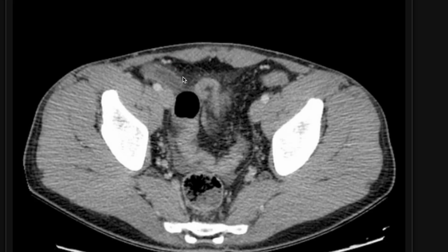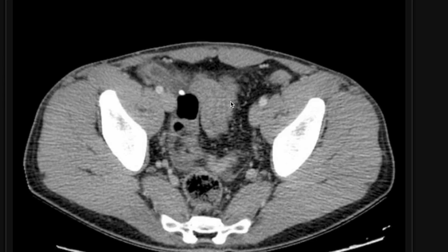Additionally, the appendix is dilated. A normal appendiceal diameter is anywhere between 6 to 8 millimeters at its maximum — this one is dilated. This is how you would measure the appendiceal diameter. It's got a hyper-enhancing wall. And it's actually hard to see because this patient doesn't have a lot of fat, but there are inflammatory changes around the appendix — a little bit of stranding of the fat, maybe a little bit of reactive fluid too.